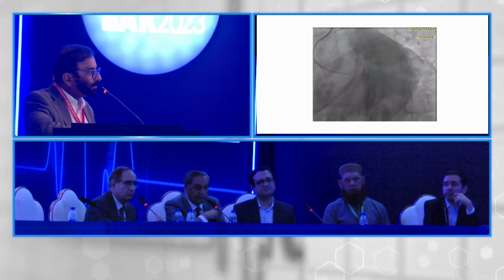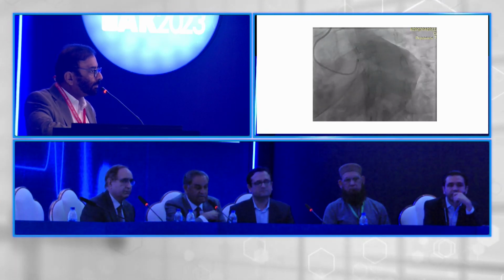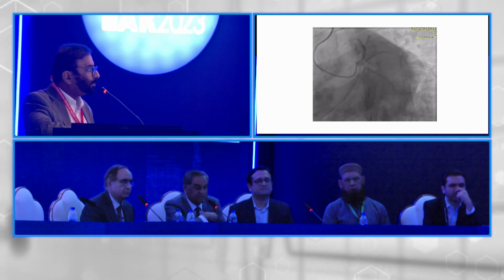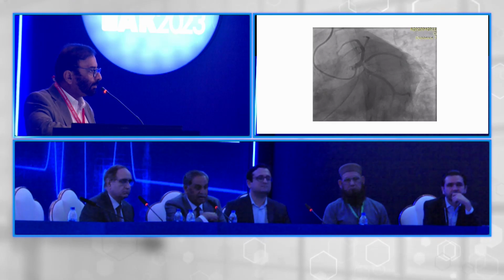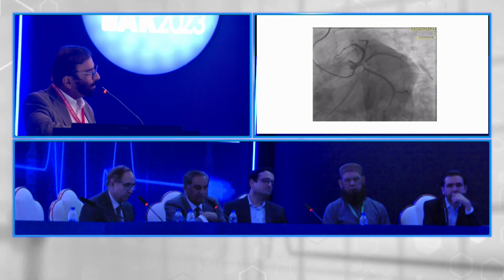But I think you'll have to keep yourself prepared for all the worst things. With a huge left main stem, you have to have the right size of stent on your shelf all the time, and all the complications you anticipate while doing these procedures should be in your mind.